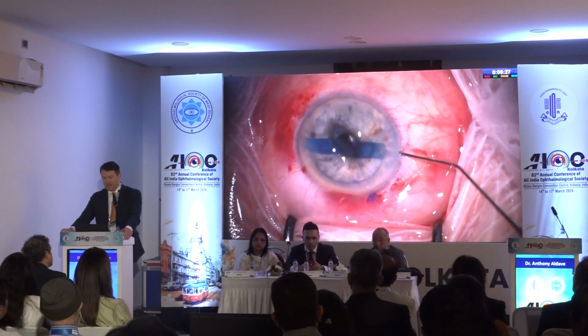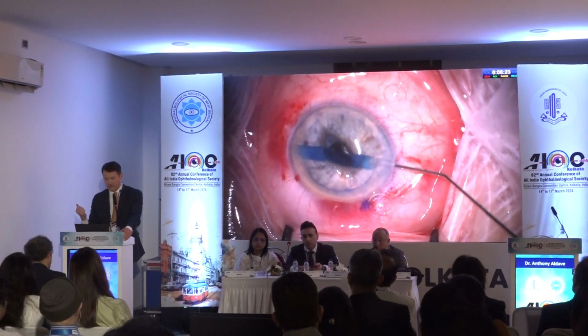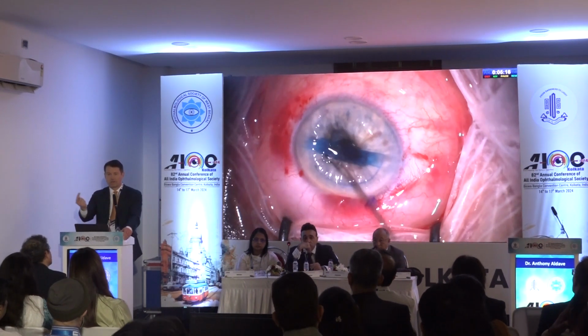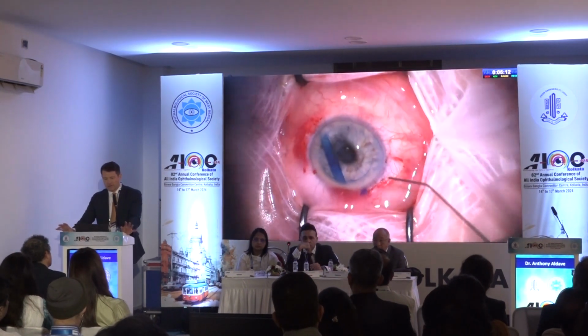I'm going to go in, and in this case, I'm not just burping fluid, I'm actually aspirating fluid out of the anterior chamber. When you do that, then you can see that whole cornea sinks. Now we have a concave cornea. You'll get that sort of annular light reflex off the concave cornea. If you're not getting anywhere, stop.